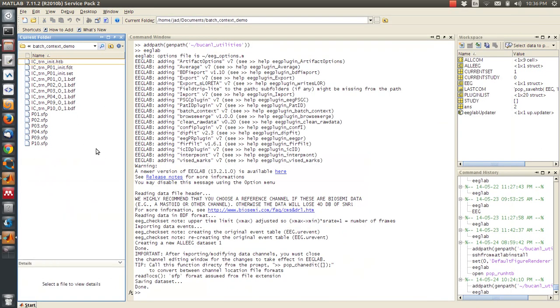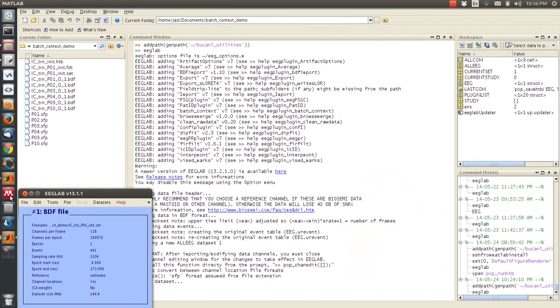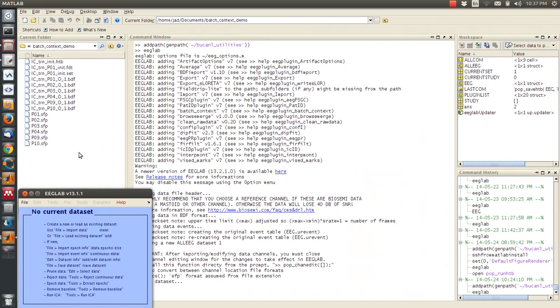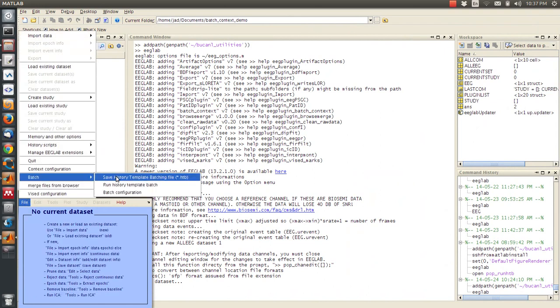Go back to my MATLAB command line, and I clear the data set and study. Go back to my batch, and then run history template batch.